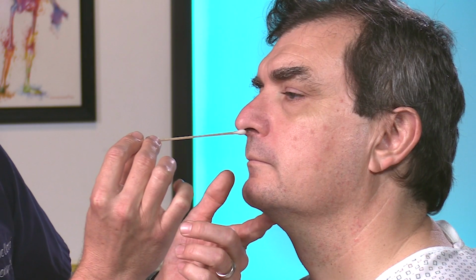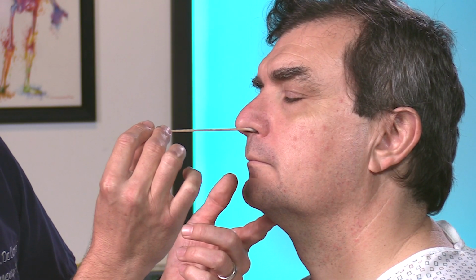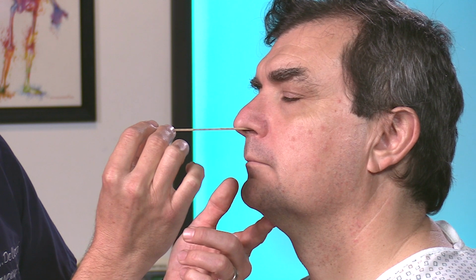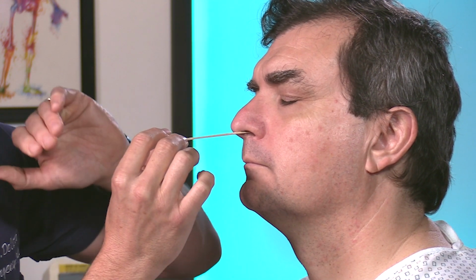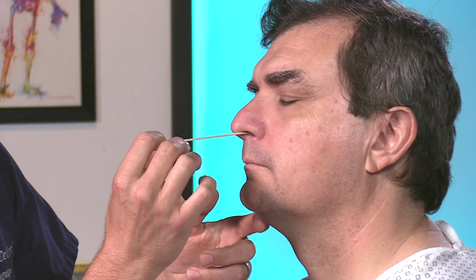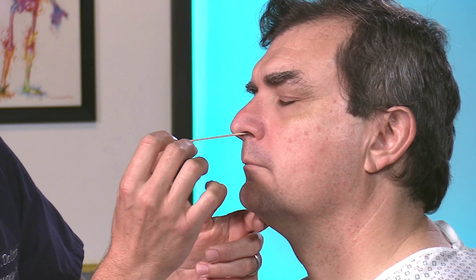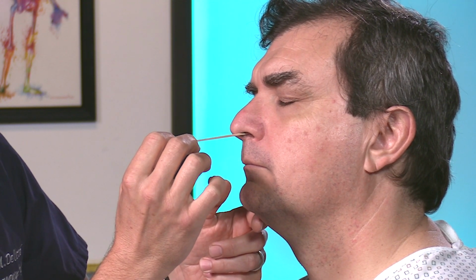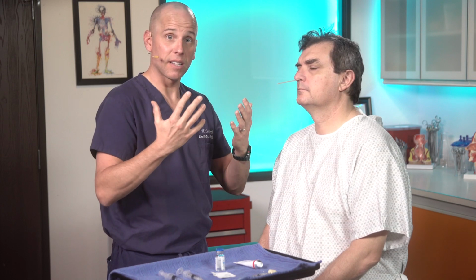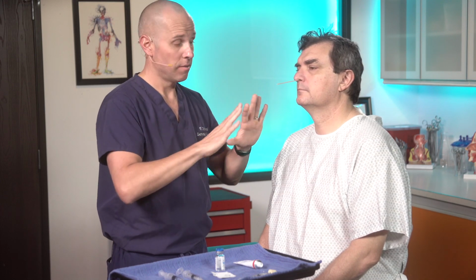And so when you're doing that movement, just stay still right here. The patient is seated here. You could have them lying down, and I just kind of twist and go horizontal up. You're going to notice it's going to go upwards towards the head a little bit. That's the normal anatomy of the nose as it goes along those turbinates until you hit resistance. And once you hit that resistance, done. You leave that Q-tip in. I will do bilateral nares in general for real bad migraines because I have better anesthesia, but I'll just leave them both there. We're not going to torture this patient.